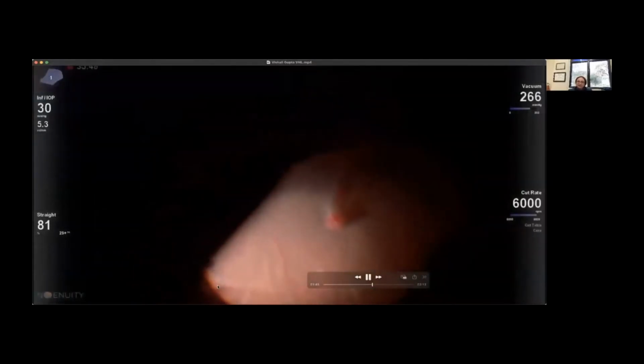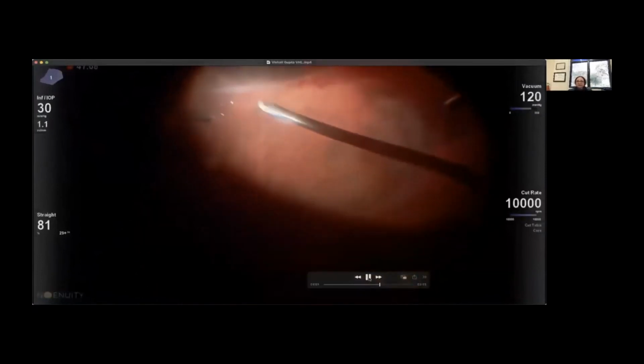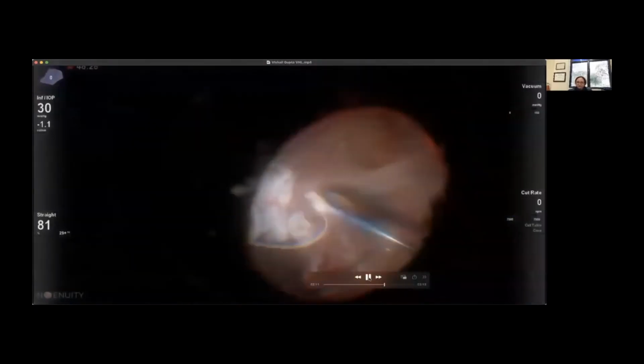Now you can see one by one, we are disconnecting angiomas from the traction bands, applying a lot of diathermy to them so that they don't bleed torrentially, but still there is a tendency. So diathermy is the key. Once you are sure that enough diathermy is done, just eat them away. The next step is, of course, since the patient had detachment, we had to clear all the periphery to make sure there was no traction.